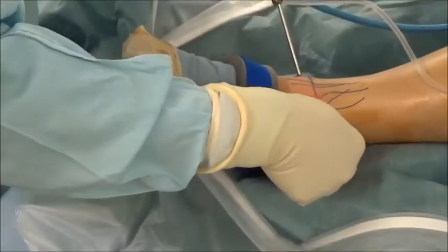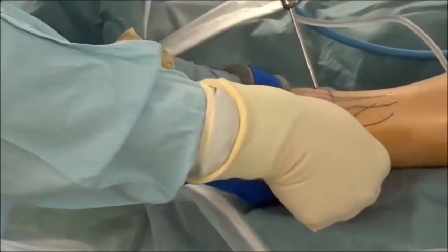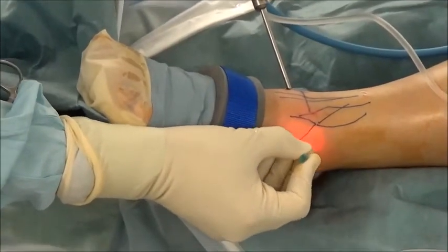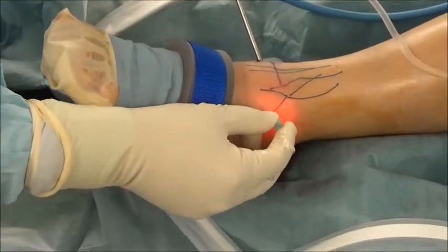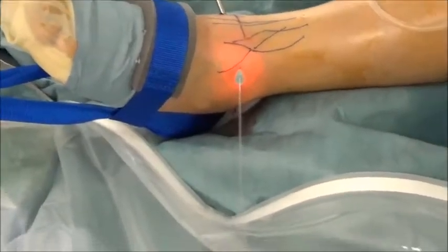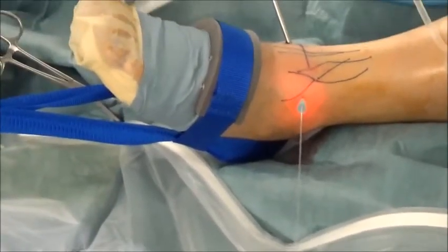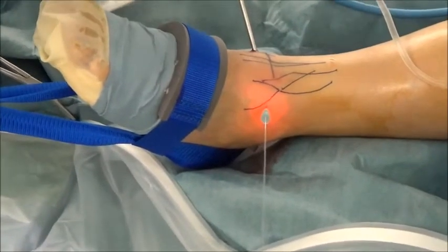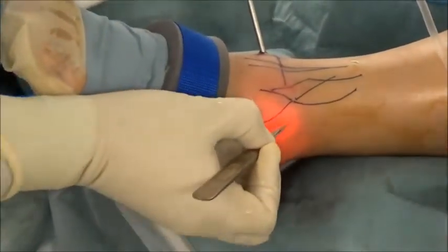For the incision of the anterior lateral portal, we visualized the vein around the point of the anterior lateral portal and checked the course of the vein marked on the skin with VeinView Flex. To check the point of anterior lateral portal, a needle is introduced into the joint, taking the marked vein into consideration.